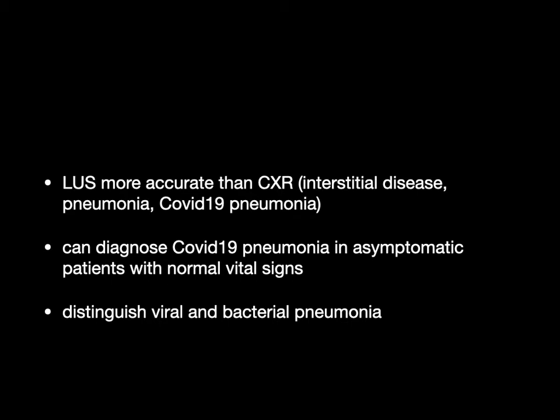As we know, lung ultrasound is always more sensitive than chest X-ray. It's as good as a CT chest. In good hands, experienced people can find tiny little abnormalities.